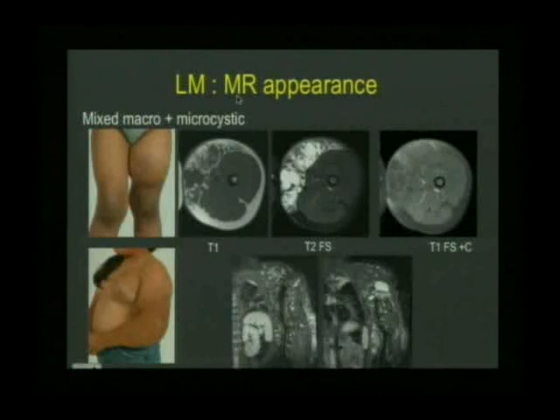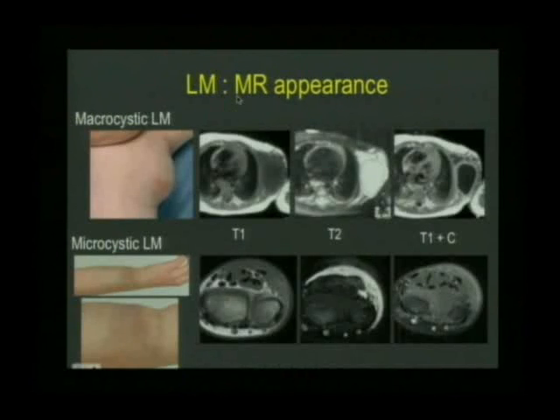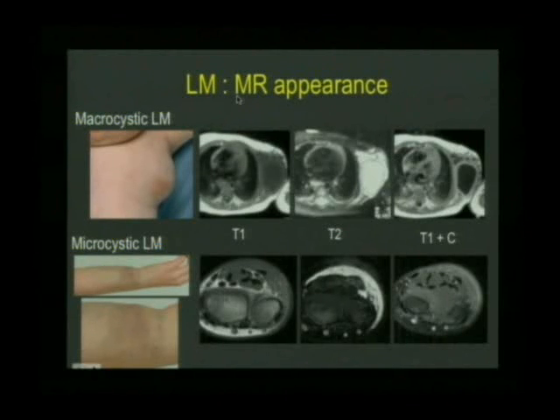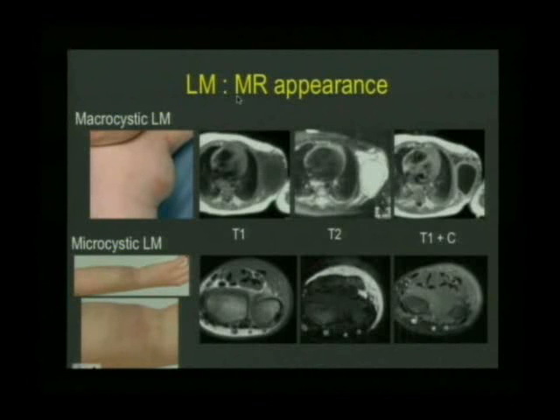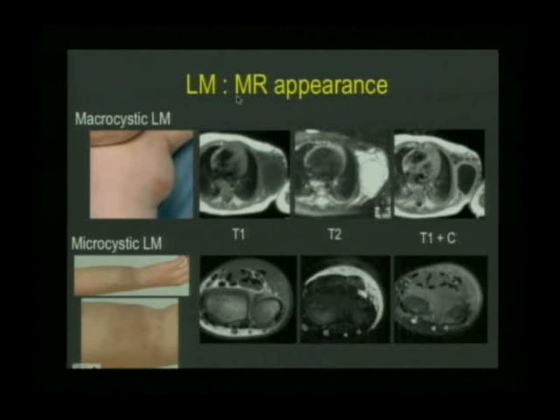On MRI, the appearance depends on whether we're looking at macrocystic or microcystic disease. In this child with a macrocyst, on T1 you can see it's hypointense, bright on T2, and the walls tend to enhance in macrocysts. Whereas in microcysts, the tissue is hypointense on T1 and diffusely hyperintense on T2, as in this child's expanded lesion in the forearm.